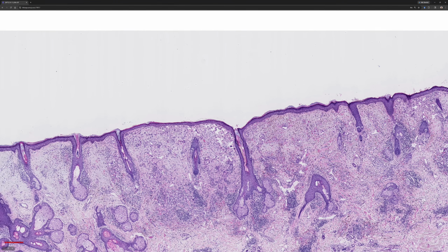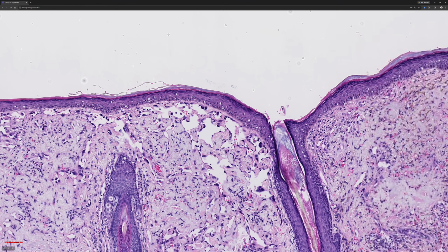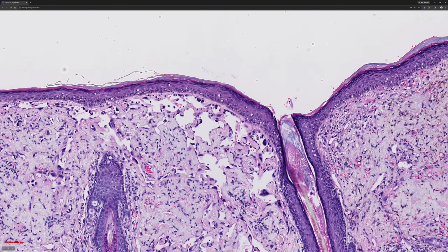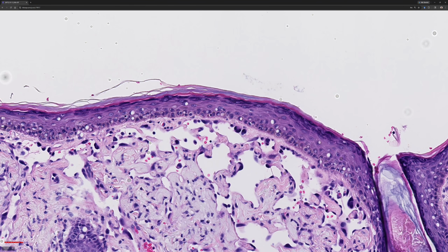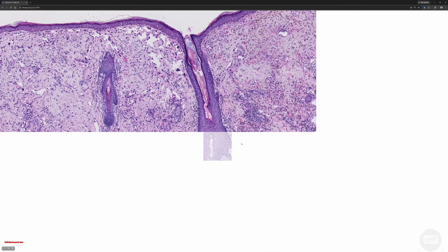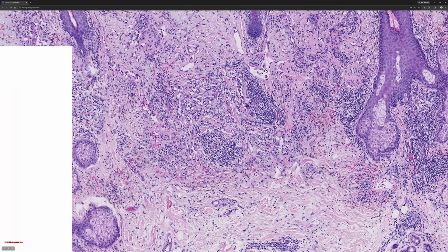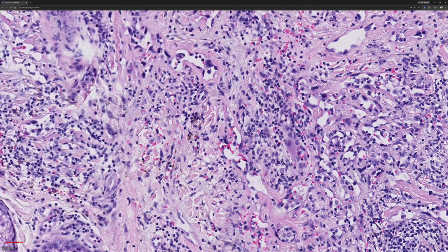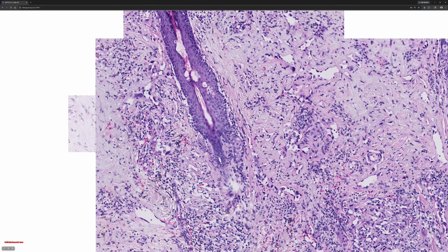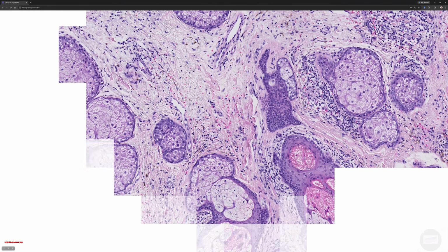All right. This is a scary example here where it kind of looks like telangiectasia, right? But too many telangiectasia and too much atypia. I've seen that on a small shave where it looked like telangiectasia, but a little too much packed together and too much atypia, and then they did a deeper biopsy and boom, angiosarc. But look how sneaky it can be, right? Sneaky channels hiding in the background inflammation. Angiosarcoma is very scary, and look how infiltrative. It keeps going and going and going.